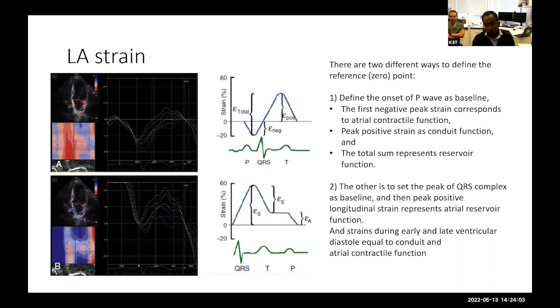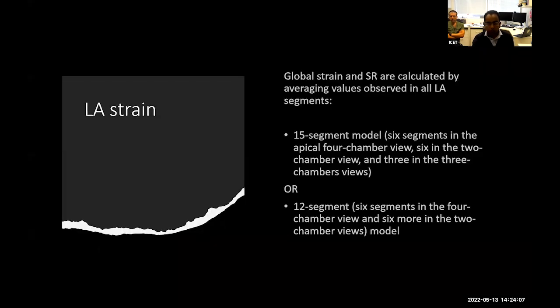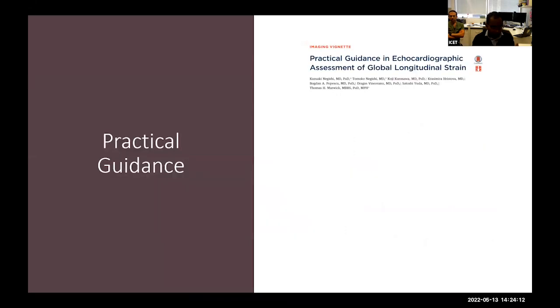I won't go too much into detail about this because I think it's probably a topic in its own. But I think what might be more useful for you guys will be the actual practical guidance in terms of how to do strain, or what the considerations are, particularly when we do strain measurements.